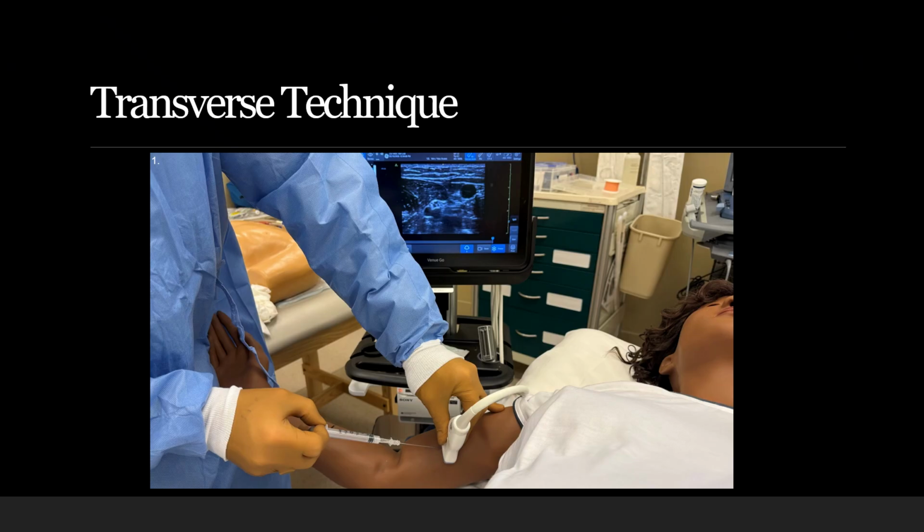So now let's go through some actual techniques when we're getting these pictures. There are two major techniques: the longitudinal and the transverse. We're going to start with transverse. So I've got my partner set up here. He's in sterile attire, of course. Simulation mannequin set up, and I've got my machine in the background. Now we've moved things around a little bit just so we can get you a better picture.